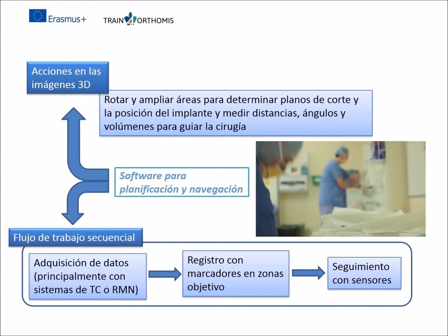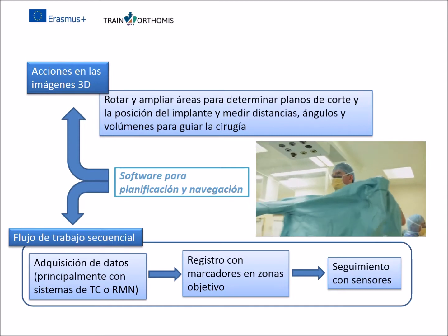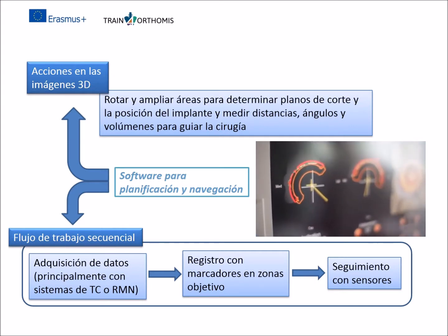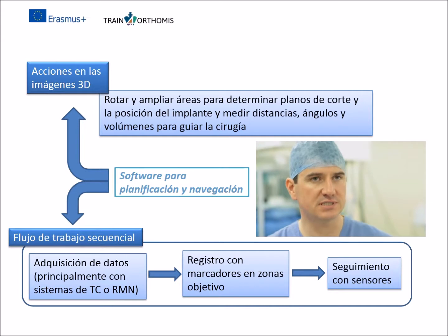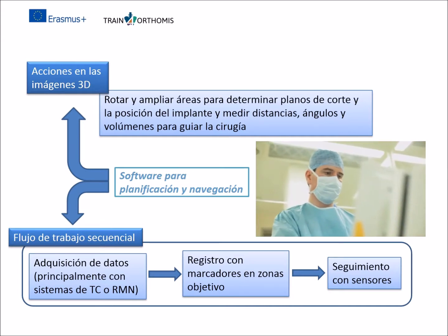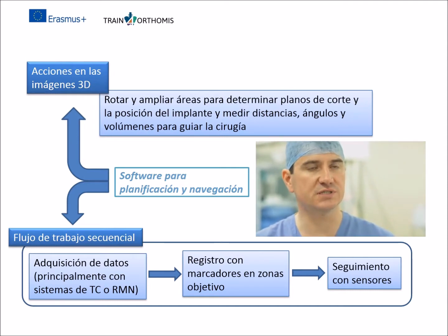And the beauty of that is that you don't have to place pins in the distal femur, yet you get a very accurate reading for leg length and offset. During the procedure and when I've closed the patient, the things are exactly where they should be. But I think in the long term we can show that these components, when put in accurately, will last longer, and we can also show that the risk of dislocation is lower.